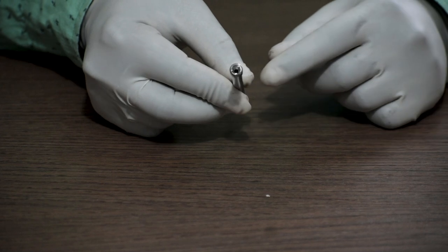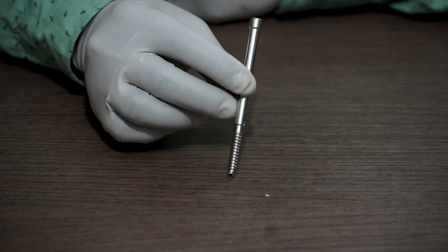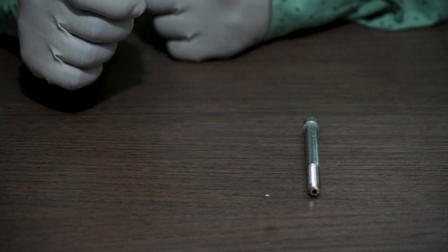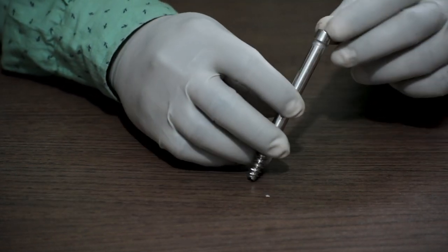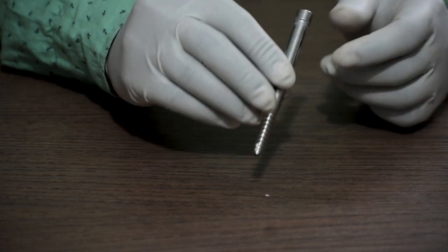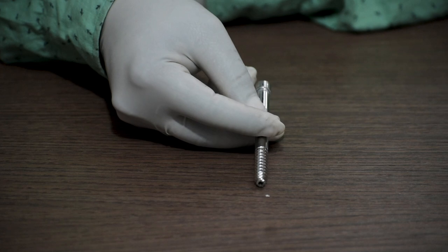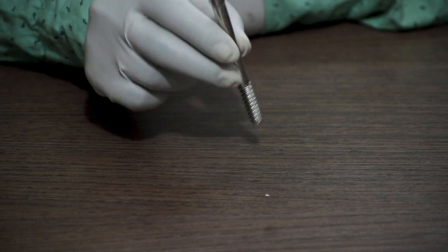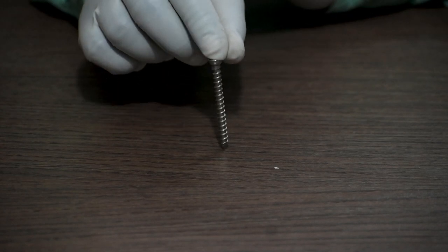50 mm to 120 mm. This interlocking bolt is cannulated and is used to fix the proximal end of the nail. Next is the 8 mm interlocking bolt, available in lengths of 50 mm to 120 mm depending upon the company. This is also cannulated and also used to fix the proximal head of the nail.